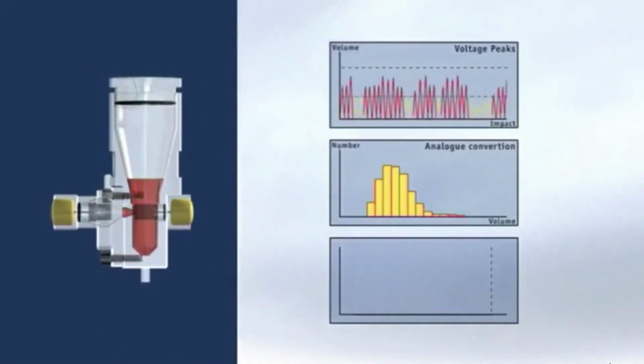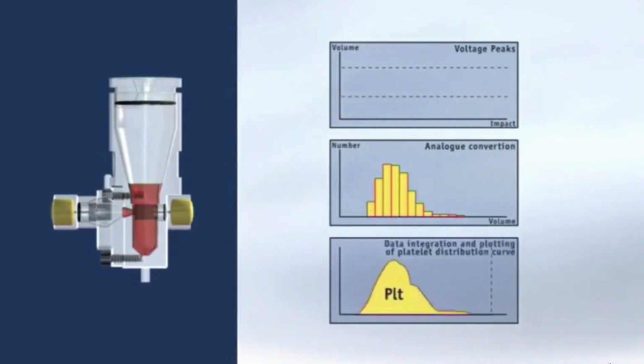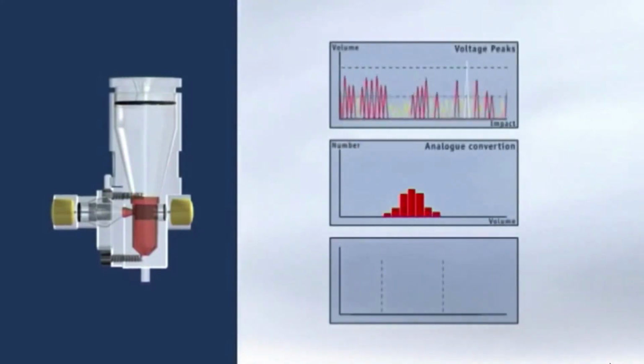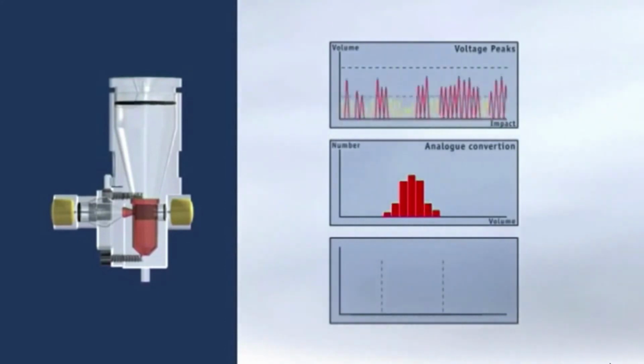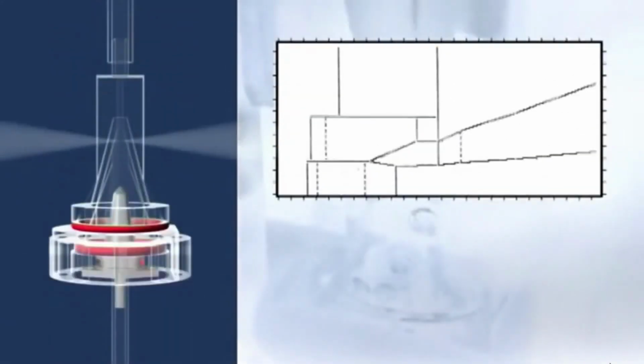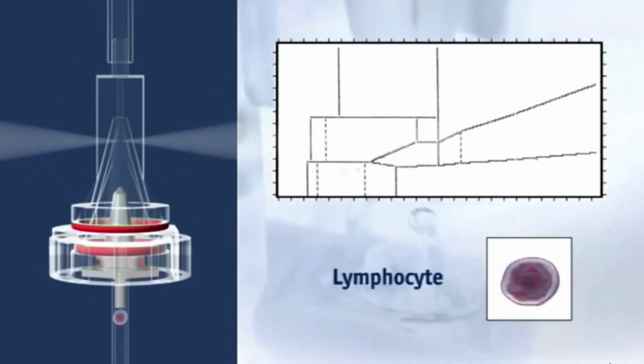Two electrodes, one inside the aperture tube and one outside the tube but inside the beaker, are placed and a current path is provided by the electrolyte when an electric field is applied. The impedance between the electrodes is then measured. The aperture creates what is called a sensing zone. Particles in low concentration suspended in the electrolyte can be counted by passing them through the aperture.